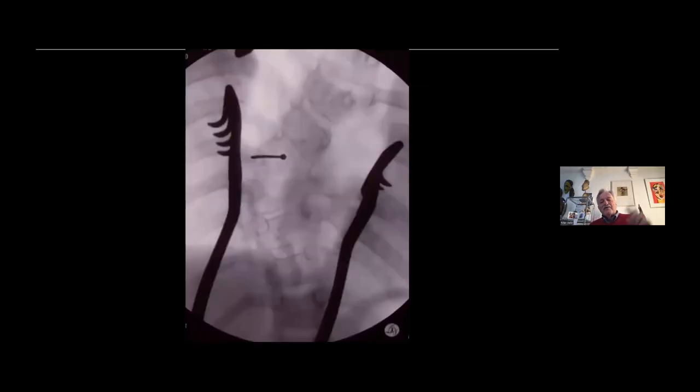I think the procedure consists of partial resection posteriorly and the resection of the hemivertebra. So if you want to be sure that you are going to do the right thing, very early on in the surgical procedure, you have to identify the hemivertebra which you believe is the cause of the scoliosis, and you have to mark it. So your incision or your preparation may depend on that. You may do a wrong preparation because from the back, the deformity looks different. The malformation may be a mixed one, so you have posterior elements which are included in this malformation. So to be sure that you will get to the hemivertebra, you have to mark it very early on, so you can go where this problem lies.